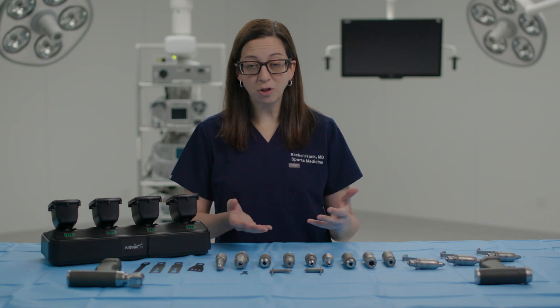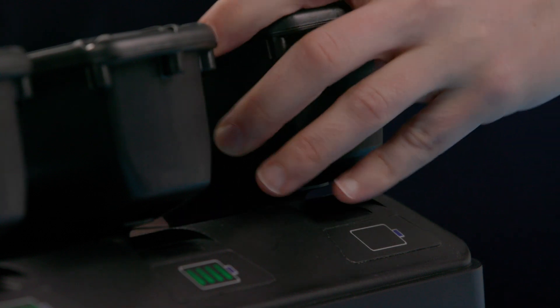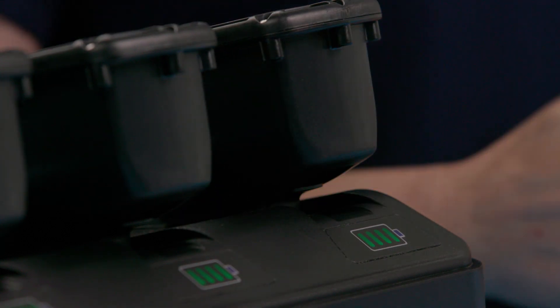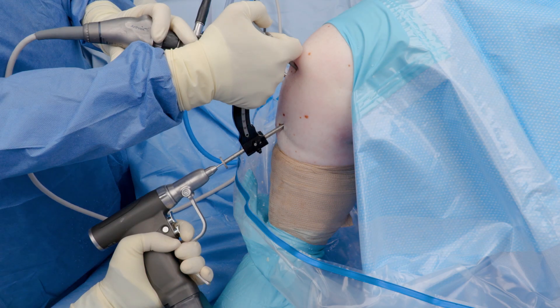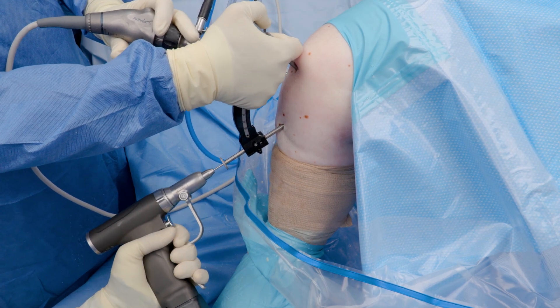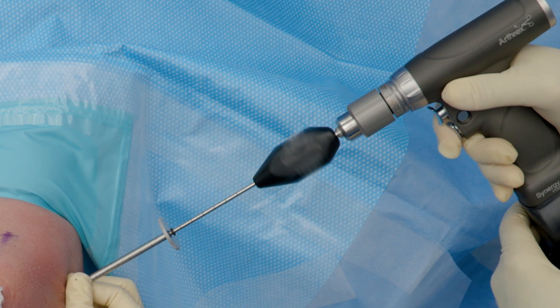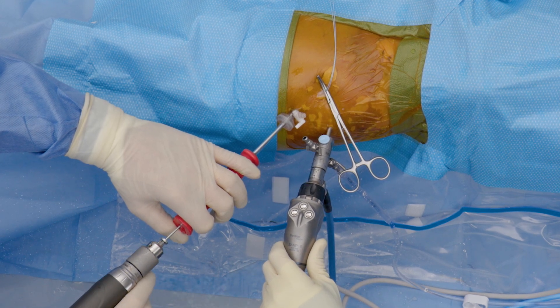One of the most unique features of Synergy Power is that this is a modular system with two handpieces. It has everything you need, but takes up so much less space than you're used to — better for your surgery center, better for SPD, better for your entire team. This system is going to save money and be more efficient, which is going to make you as the surgeon and your team at the surgical center much more happy, and ideally provide cost savings to the entire system.